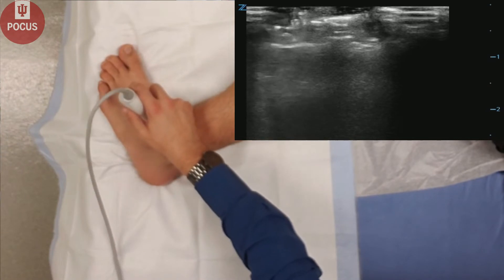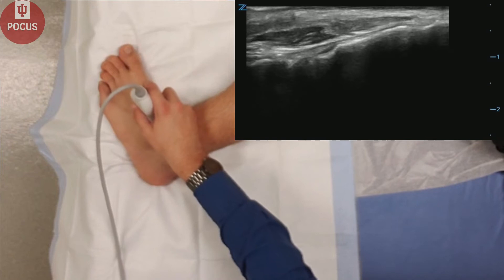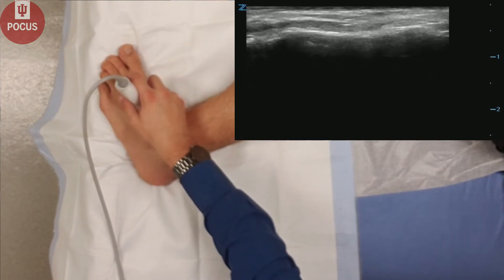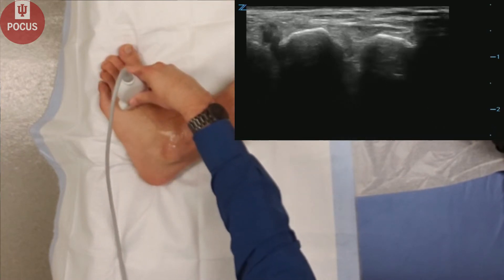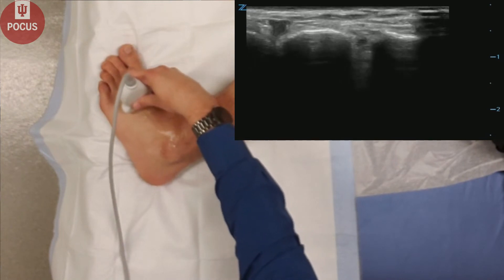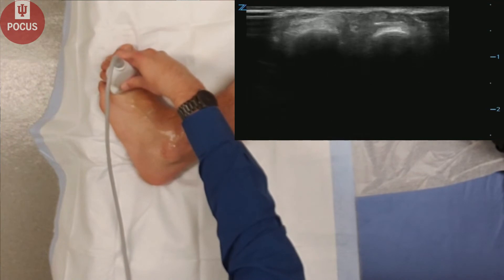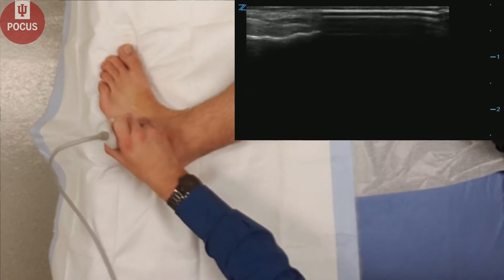We can also look at various metatarsal and tarsal bones, both in long axis and in short axis. If there is any clinical indication for fracture — say, a trauma with point tenderness on the midfoot — you can use the ultrasound to identify any cortical disruptions or cortical irregularities, signs of midfoot fracture.